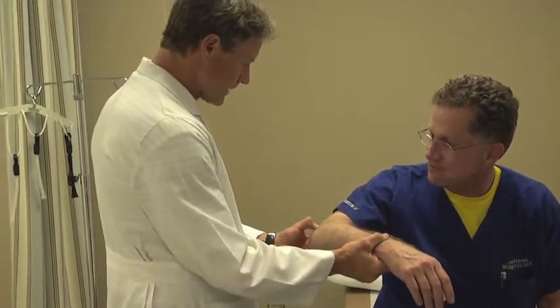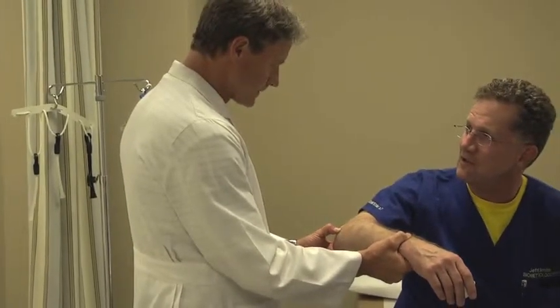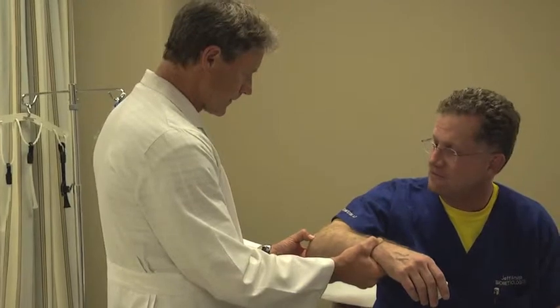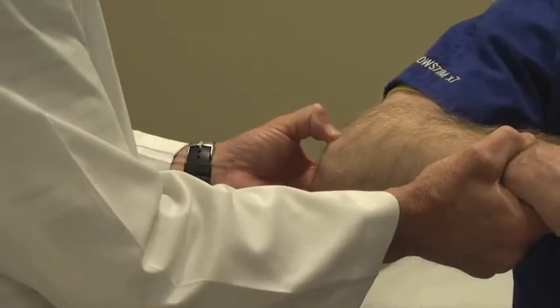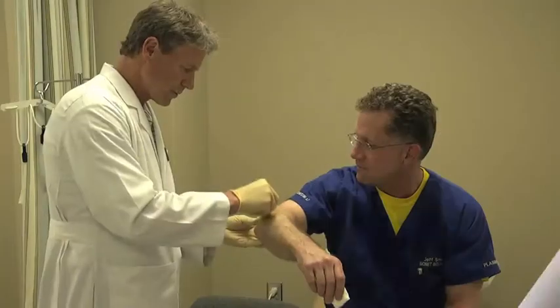Next, we'll identify the injection site on the patient. Here we're looking for the most sore area in the tendon region of the lateral aspect of the elbow. Basically, this is an injection for tennis elbow, or lateral epicondylitis.